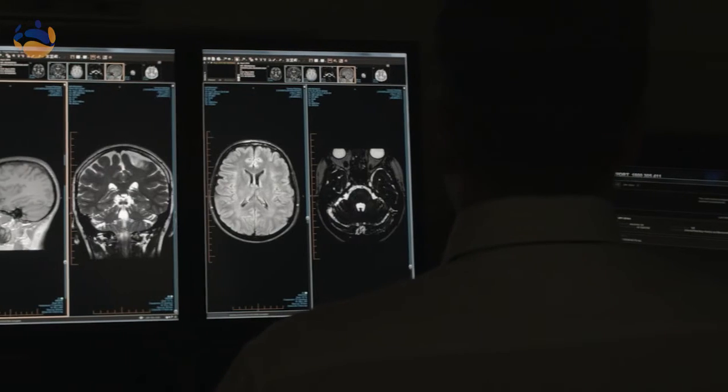Unfortunately, we can't give you a result straight away. Once we've finished your child's scan, we will give these images to a dedicated radiologist. It takes the radiologist some time to properly look and evaluate your films to be able to give your referrer a diagnostic report. So you'll need to go back to see your referring doctor to be able to get the results from your scan today.